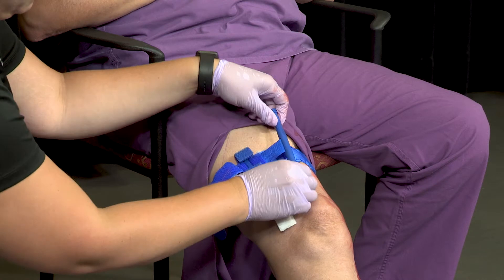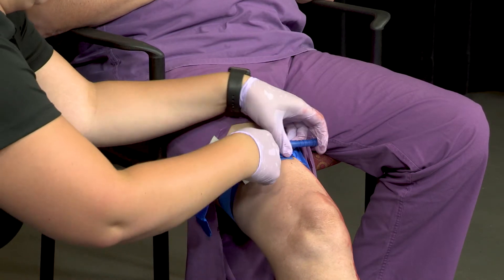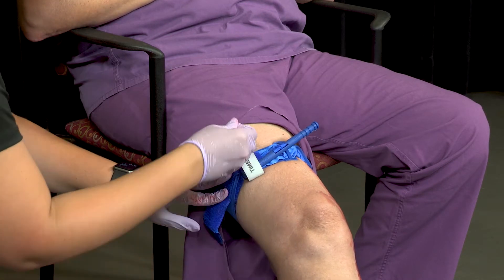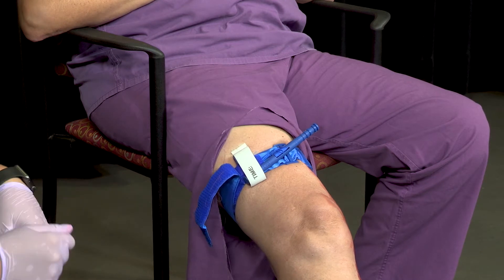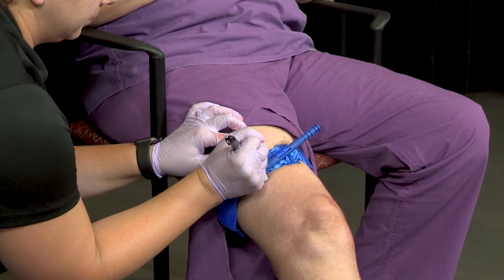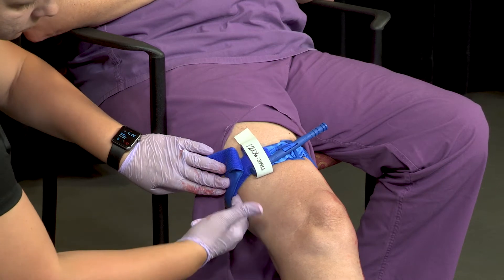Next, twist the windlass until the bleeding stops, then secure the windlass under the clip. The white time strap should also secure the windlass. Write the time on the tourniquet with the marker. If the tourniquet is placed properly, you should not be able to slide your finger between it and the victim.